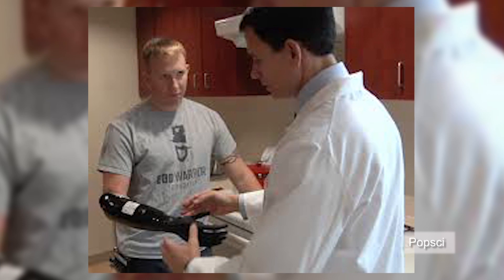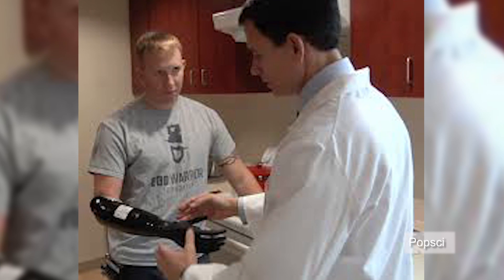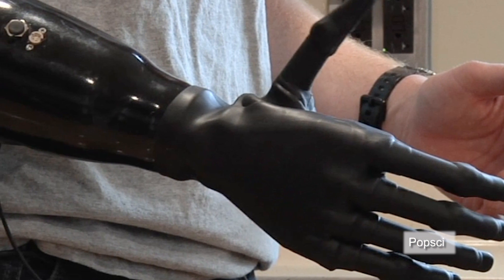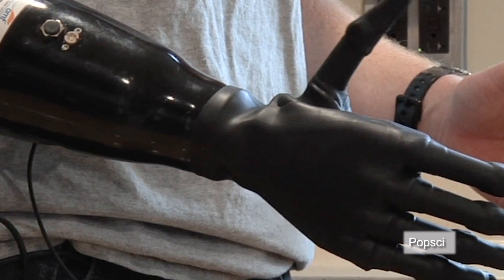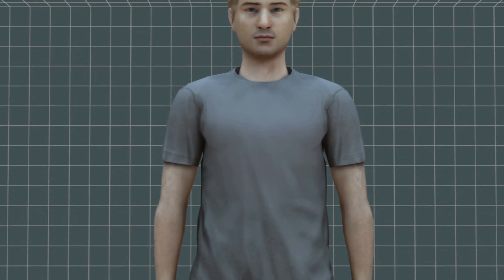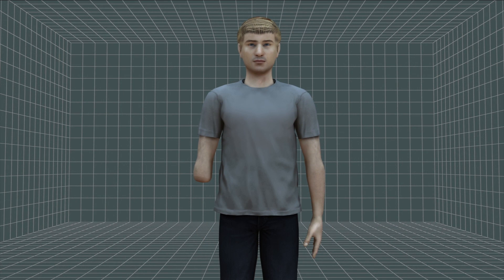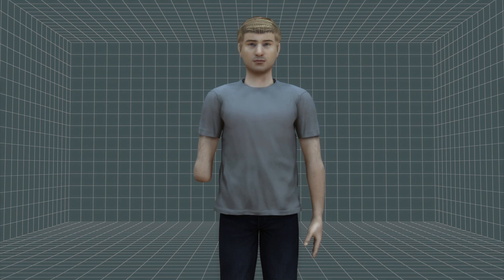The Alfred Mann Foundation has unveiled implantable myoelectric sensors that can help a patient control a prosthetic limb by reading the wearer's residual muscle movements. Staff Sergeant James Sides lost his right arm in an explosion in Afghanistan, and now he's the first patient to test a myoelectric prosthetic hand.